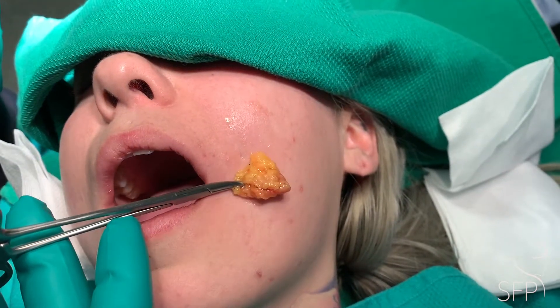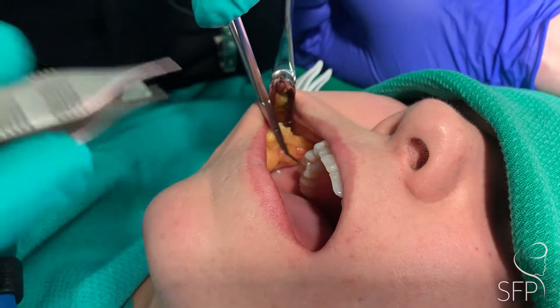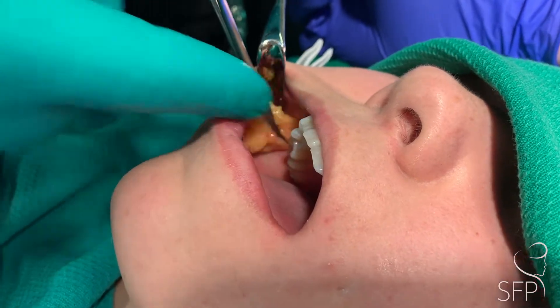Demonstrating how much fat was removed from the first side of the buccal fat extraction. Hey everyone, I'm demonstrating buccal fat extraction through a small incision inside the mouth just behind the upper molar.